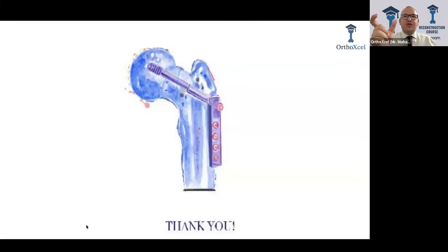If you're using like a 44 stem rather than a 37.5 stem, you're increasing only the horizontal offset, but that's not true because the vertical offset changes as well, but to a very, very minimal degree. So practically, you feel like you changed the offset only, but actually you changed both, but without clinical implication of increasing the vertical offset. Even with modular prosthesis.